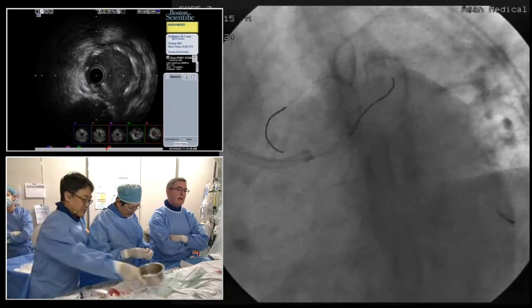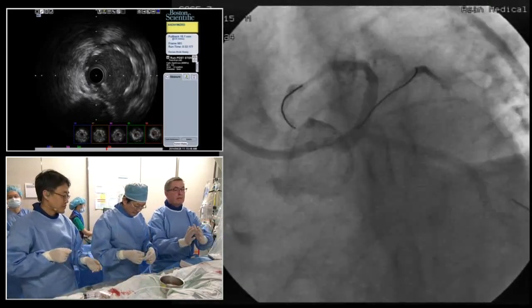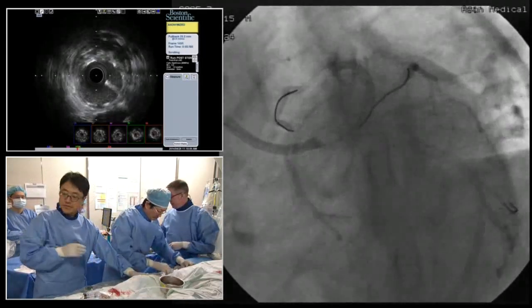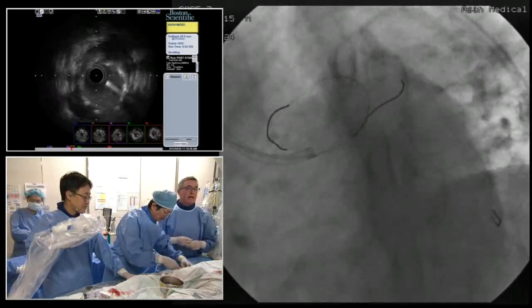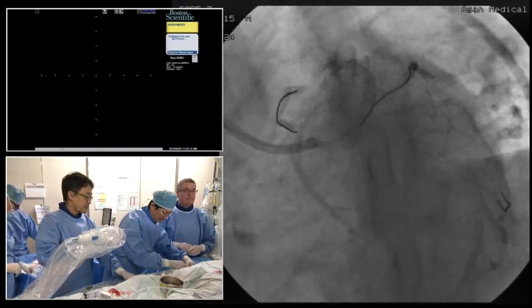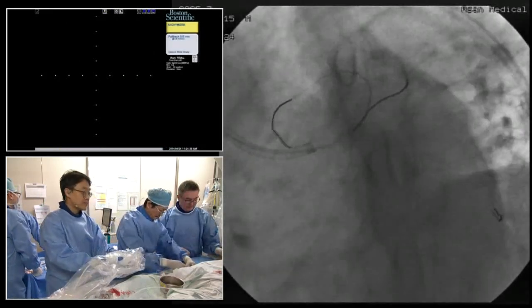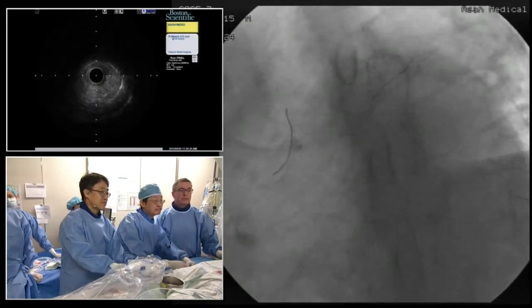I think I'm happy with the way it looks. You notice how the stent has grown nicely for the left main, and we haven't compromised the circumflex at all because it's a soft plaque. And because we haven't gone aggressively with the distal end of the stent, we haven't got the diagonal in too much trouble. Do you think we'll have a look with IVUS? I would agree with you here. Probably less is more. It's a good rule, isn't it?